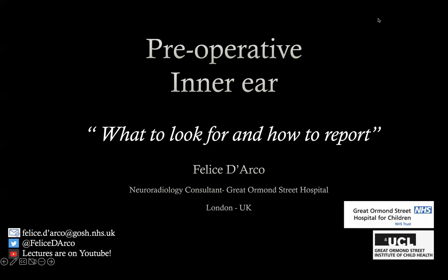Today I'm going to present a lecture called Pre-operative inner ear, what to look for and how to report, which is a lecture that I've done for the European Society of Neuroradiology, in particular for the European course of pediatric neuroradiology that took place in Spain, February 2025.